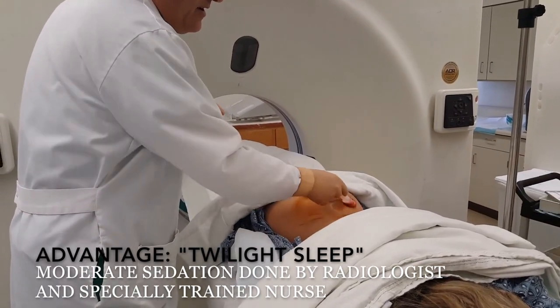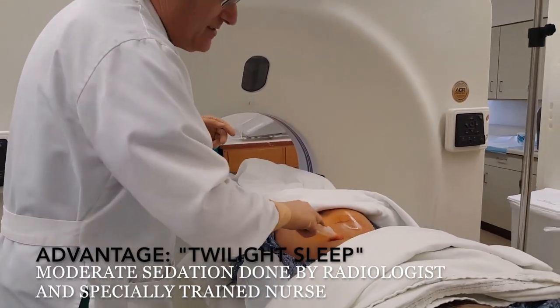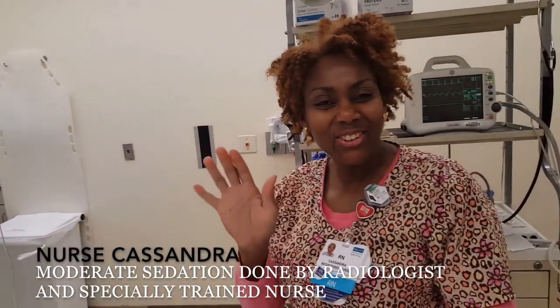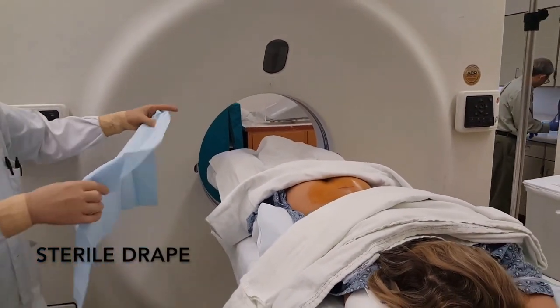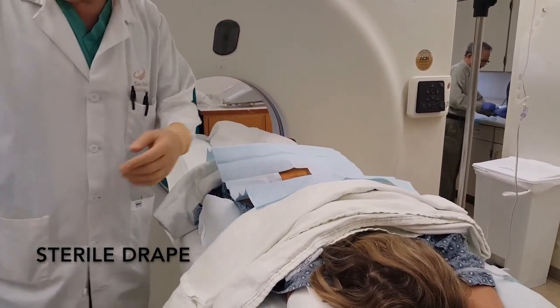The other advantage of doing it in radiology is we have a wonderful nurse here who's giving the patient some medication to help her through the procedure. I'm making her comfortable — a little beach. And she's feeling very relaxed now. Let's take up the chlorhexidine. Now the sterile drape.